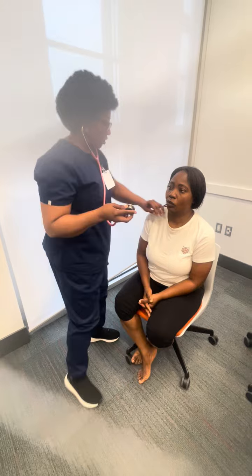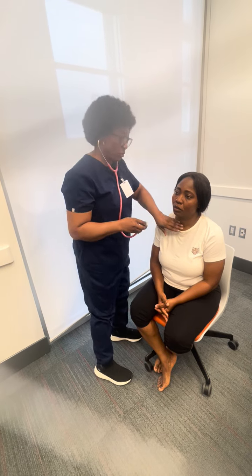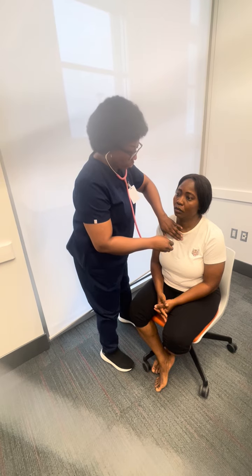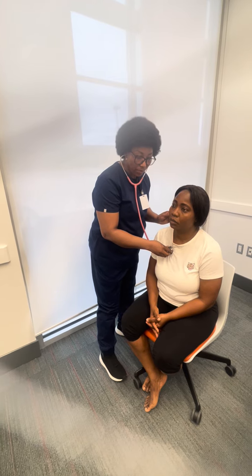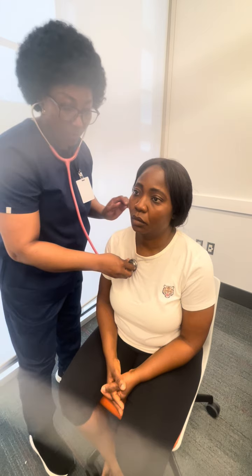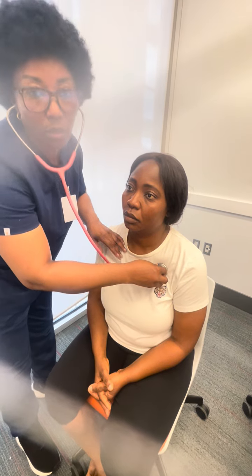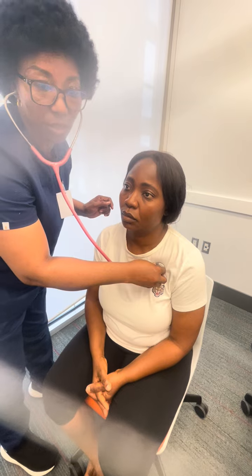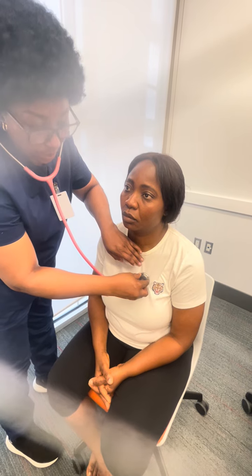Okay, so I'm going to be checking for a heart sound. I'm going to be doing that with the diaphragm of the stethoscope. First, I'm going to look at the landmark of Louis. And to the right, which is the second intercostal space, right sternal border. Okay, to the opposite side, that's the aortic valve. Now to the pulmonic valve, which is the opposite side, second intercostal space, left sternal border. Now I'm going to move down to the Erb's point, which is the third intercostal space.